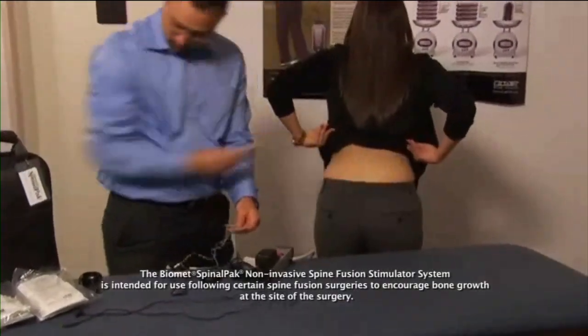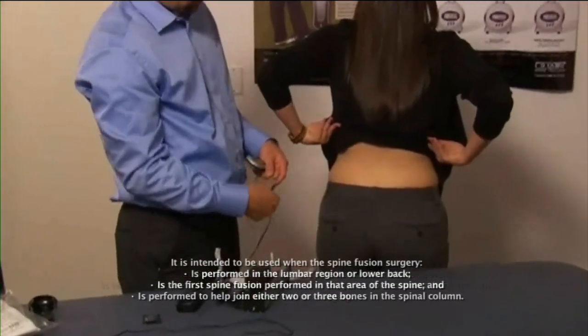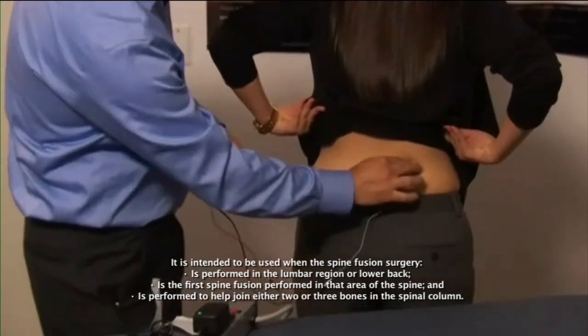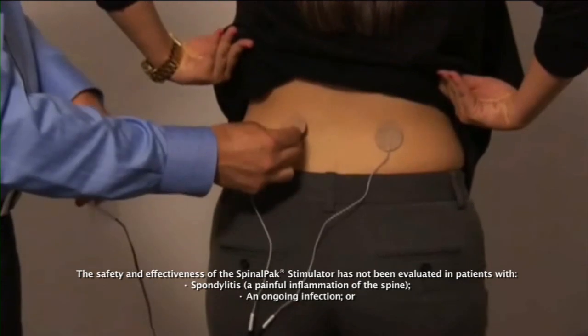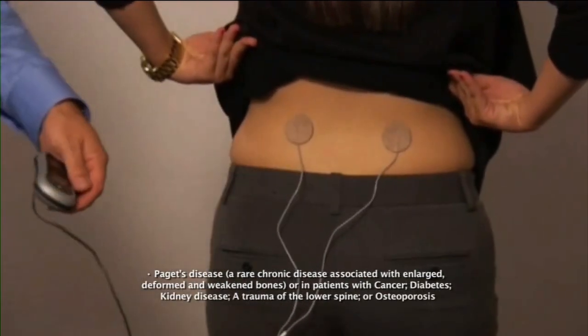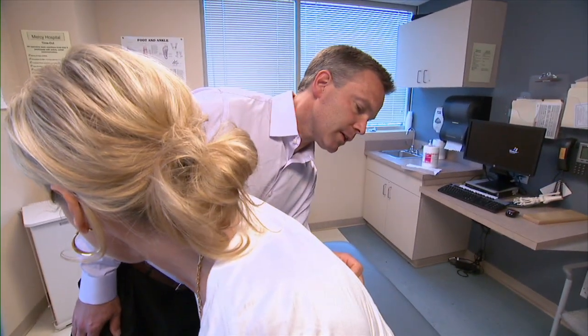Years of clinical evidence supports improved healing for lumbar spine fusion surgery treated with electrical stimulation. Similarly, these devices are used on patients after primary lumbar spine fusion surgery. With over 300,000 lumbar spine fusions performed each year in the U.S., advancements in technology may improve healing outcomes for patients. A spine fusion is indicated in patients that have failed medical management of their back condition and patients that have instability where the vertebrae are moving inappropriately with each other. Today's technology is remarkable for helping indicated patients achieve successful spine fusion.